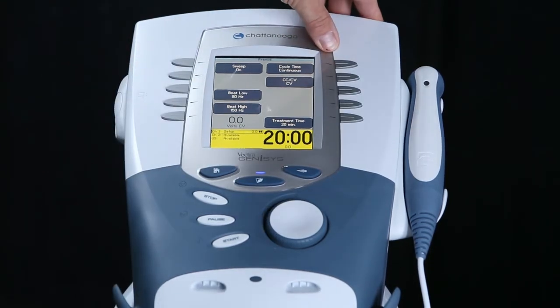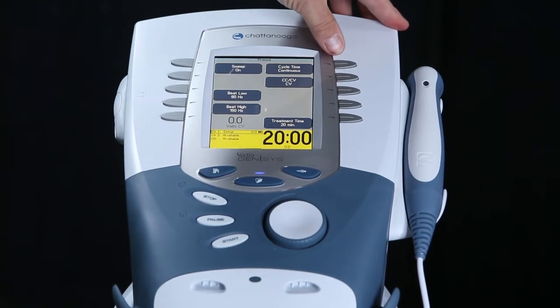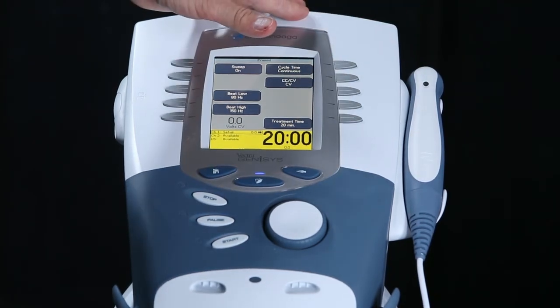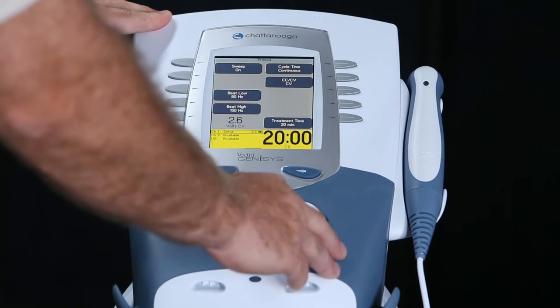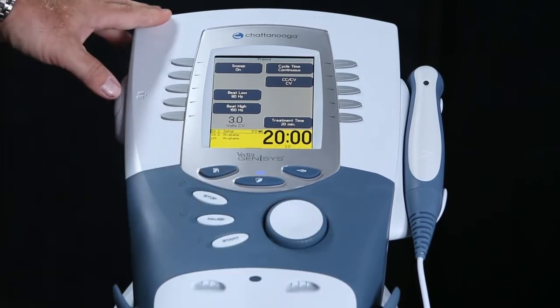The cycle time will be continuous and will be set on constant voltage. Since it is continuous, that will create a more comfortable treatment for our patient. Our treatment time is now 20 minutes. At this point, we'll turn up our amplitude until the patient feels it. Once they feel the current, we will then turn it up to a strong sensory feel.